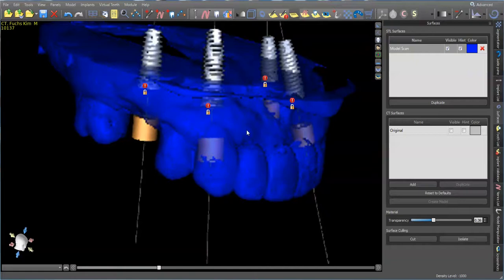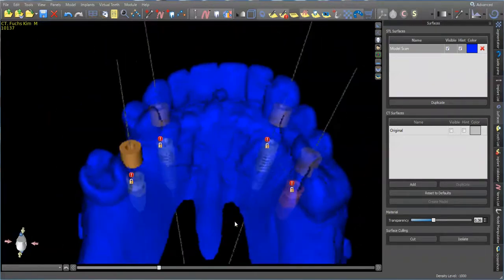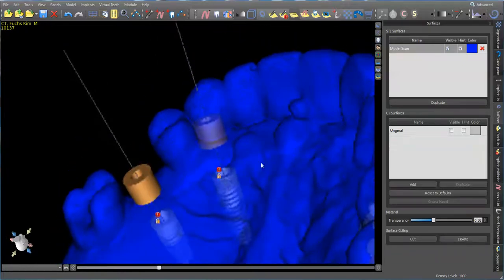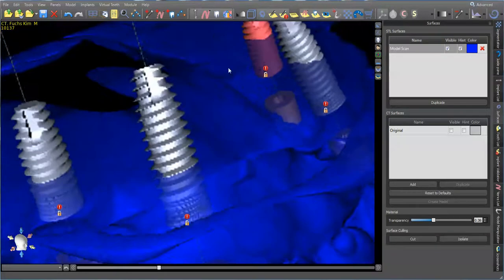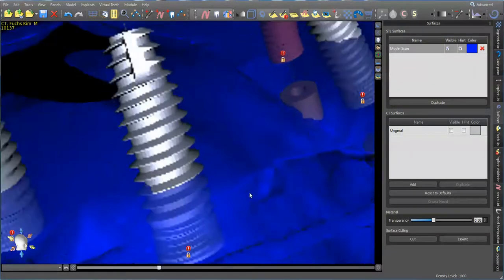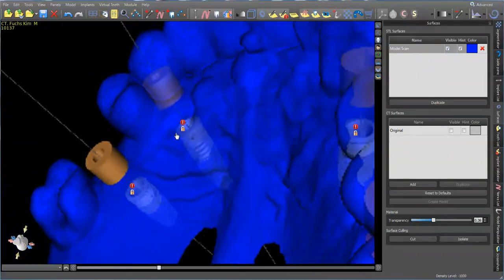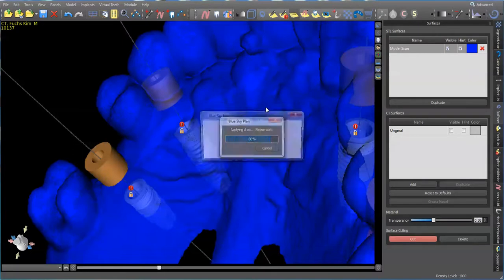I like to put it at an angle right here so I'm not accidentally cutting anything on the opposite side. Or you could even do something like this. This would probably be even better. What you have a tendency to do is, if you're cutting like this, then you inadvertently cut back here if it's not in the right trajectory format. So I'm going to use this right here and just press cut tool. You don't have to hold down shift, you just go ahead and do this. That'll eliminate those 2 teeth.